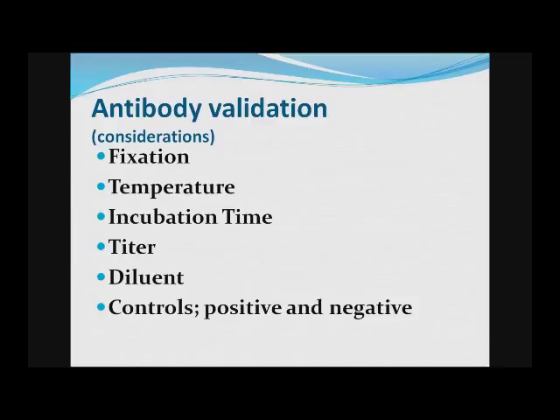Now, things that we need to always remember and consider is, what is your fixation? What is the temperature? If you have heat available on your stainer, or you prefer to use heat, what is that room temperature versus warmer temperatures going to do? What about your incubation times? What is the titer? What is the diluent? All antibodies are not happy in the same diluent.